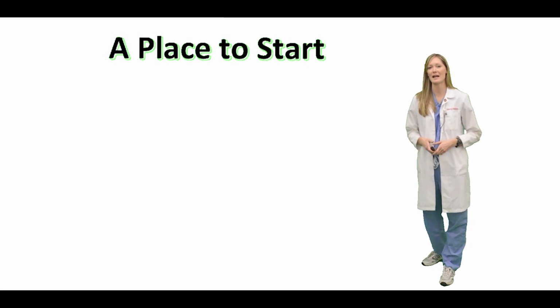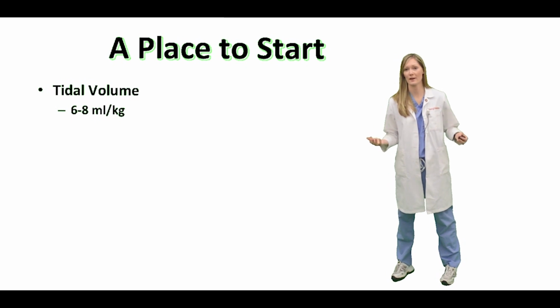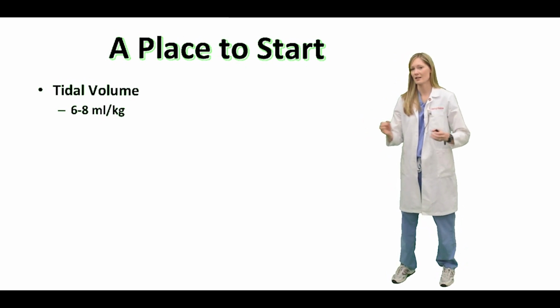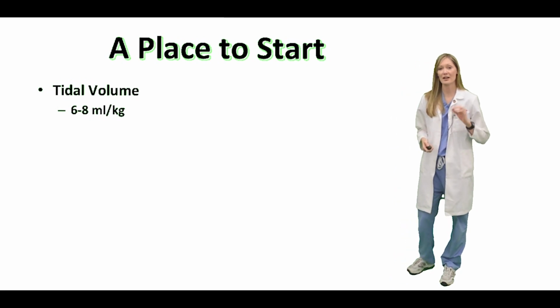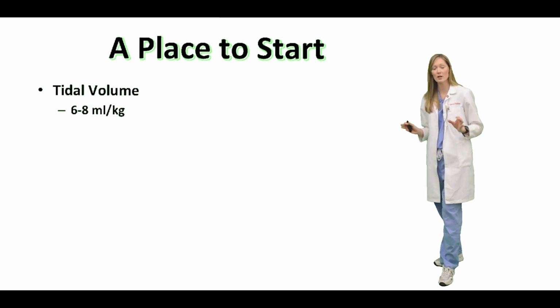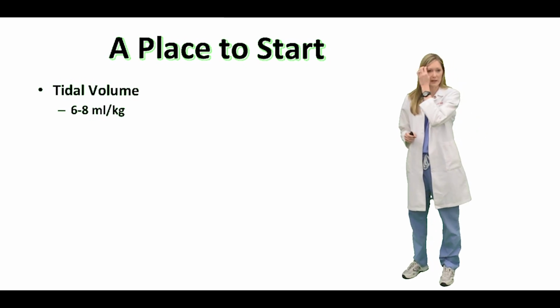The first thing you're going to be asked about when you're setting ventilator settings is your tidal volume. Respiratory therapists will say, hey doc, what kind of tidal volume do you want? And you say, don't just pick a number and use it every time. We actually like to start with something in the 6 to 8 mLs per kilogram ballpark. Remember, that's not the patient's actual body weight. That's going to be using predicted body weight.